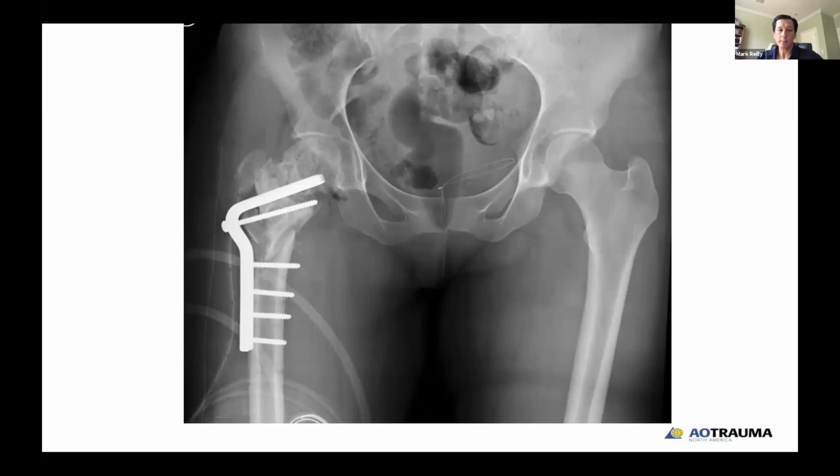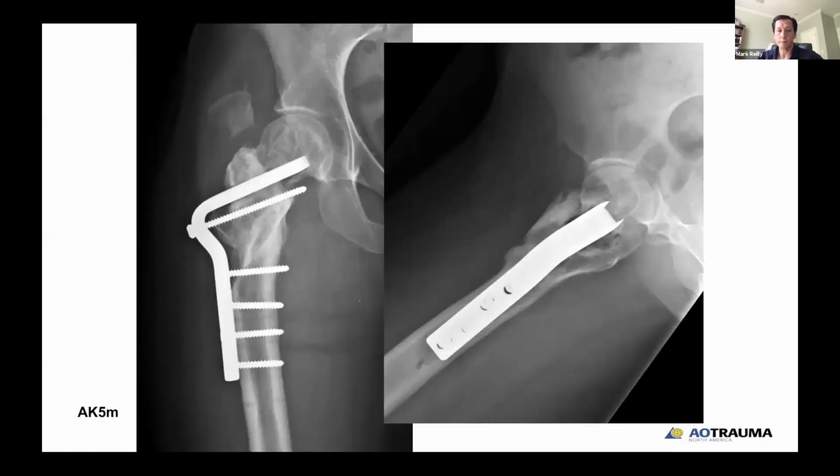Here she is post-operatively. I think if you get advice from people about your cases, you need to show them the post-operative x-rays. And so I had the opportunity to show the x-ray to Jeff Maston, to Keith Mayo, and to other colleagues and friends. And everybody said, why didn't you fix the trochanter down? And yes, 5 months later, she's healed her osteotomy, and her trochanter escaped and broke off the top of the blade. Totally avoidable complication on my part.